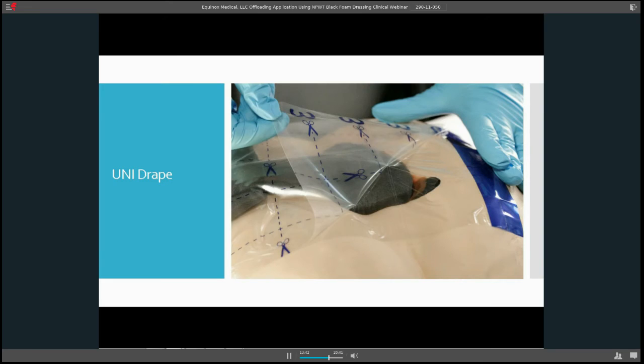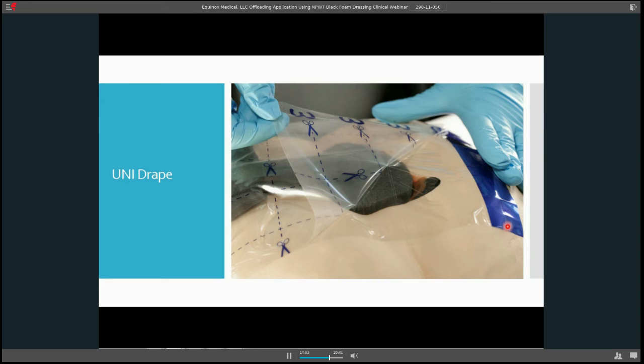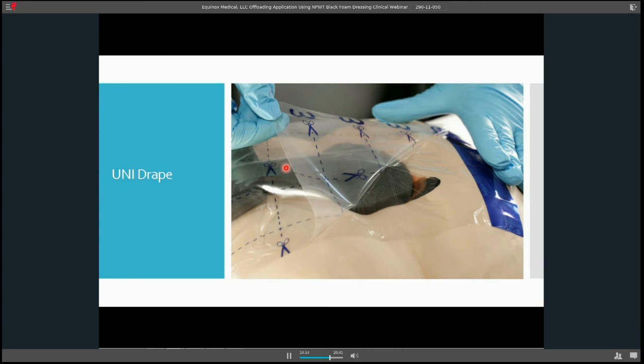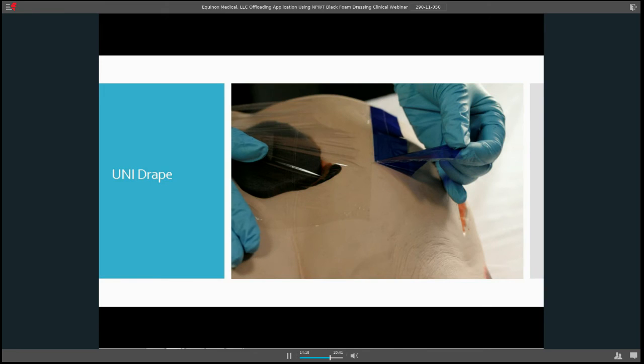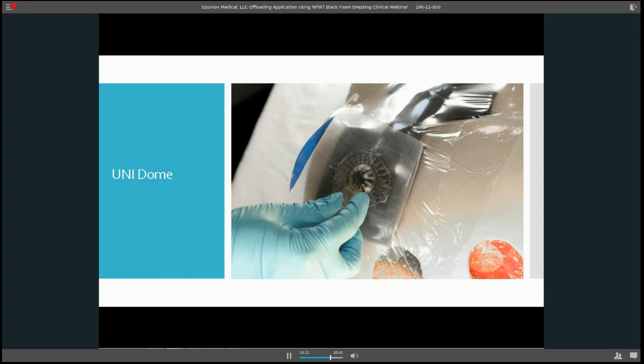Now I'm taking off number two from underneath. On both sides of the transparent, there is an area that you lift this up and you go underneath and there's a little piece that you just pull out from underneath and smooth down and make sure your edges are sticking. On number three, if you were able to see the last dressing change a few weeks ago, I show how number three comes off nice and easy by holding this end of the blue tab. If you can see very carefully, there's a little bit of a serrated edge right there. That's where this picks up from. You don't have to flick the edges. You just need to pick that third layer up right from there and it comes off so easily. It's very easy to work with. Pull off my blue tabs.